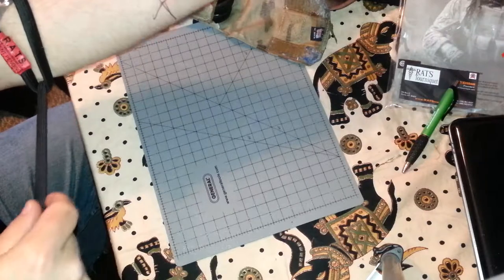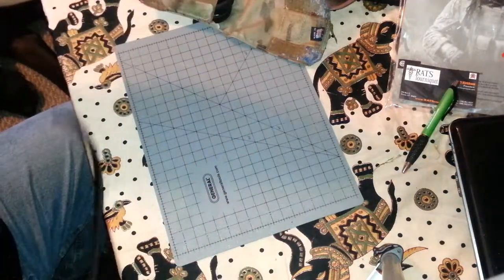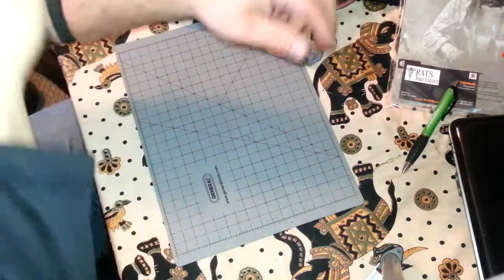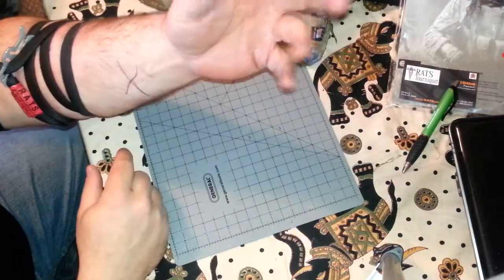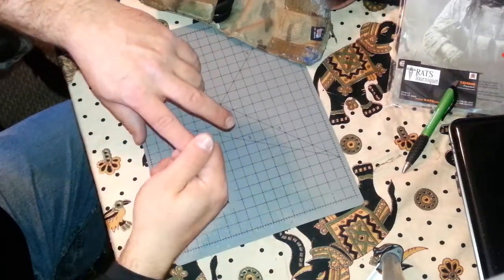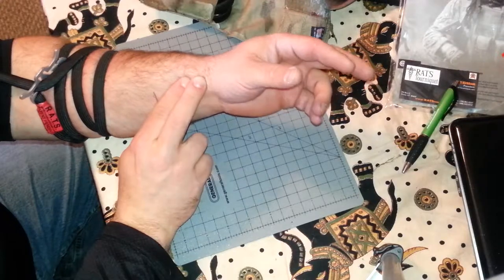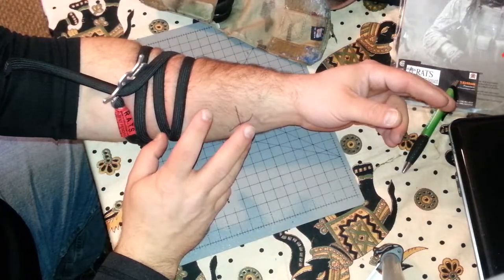We're going to do this as if I'm actually hurt. You pull it tight — see me deforming the skin — bring it around, make sure you have a good two inches of strapping overlap. Now you use the cleat to lock it down. My arm hurts — it is painful when you put a tourniquet on. Blood flow is completely cut off. How long did that take? Maybe 10 seconds, tops.